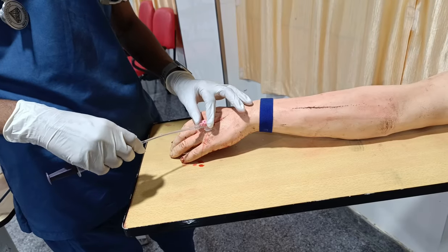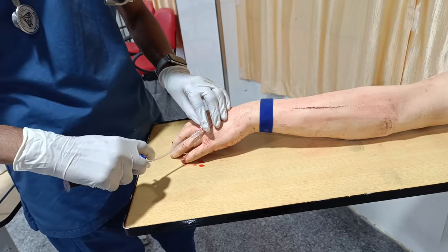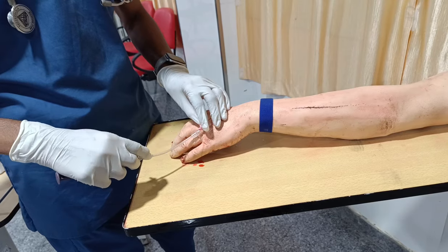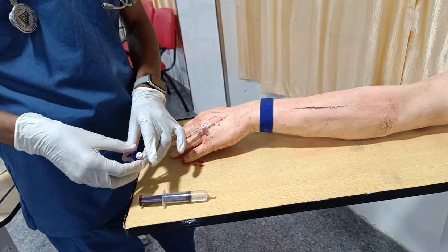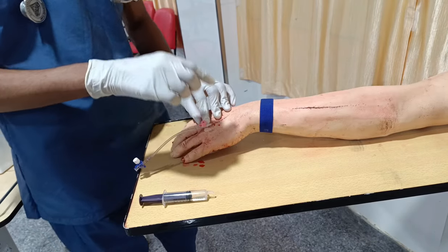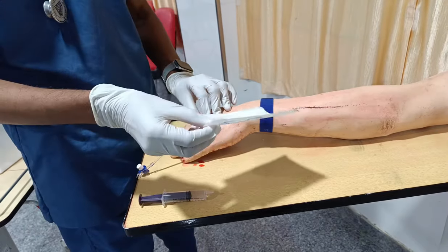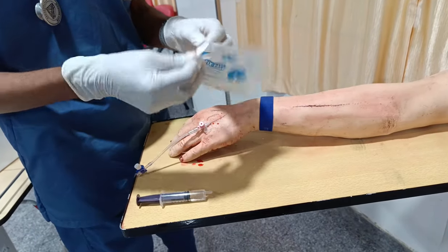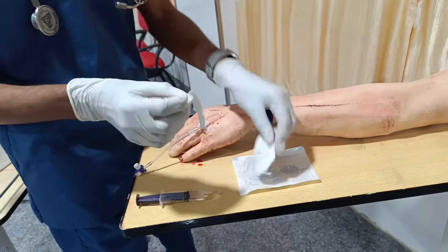If it is going well, I can stop through this three-way stopper, and then I can remove the needle. Make sure the catheter is not dislodged, so always keep one hand over the catheter. You can ask your aide to open this IV fixer, the IV dressing.